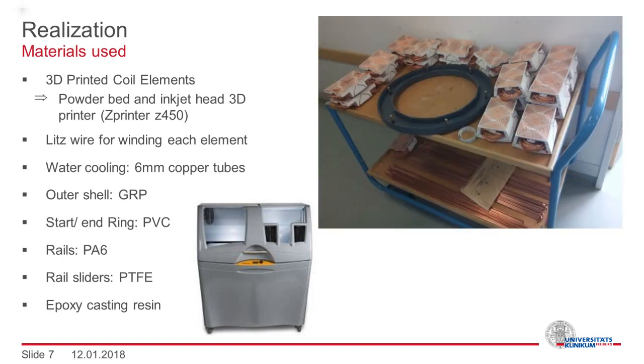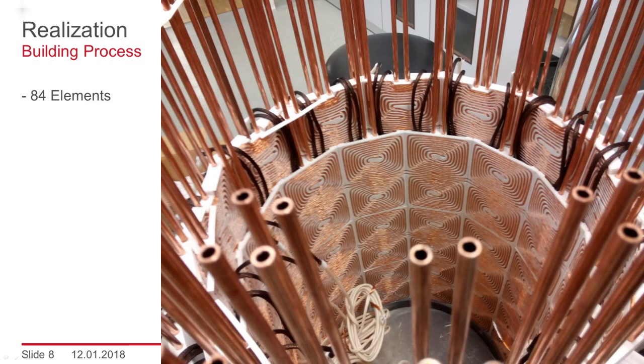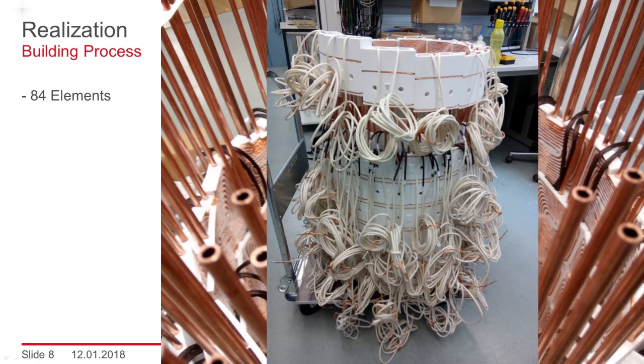In this image, you see everything which is needed to get started: a start ring, all elements for the first two rings, and the copper tubes for water cooling. During the assembly, all elements were slid down the cooling tubes ring by ring. Here you can see the inside of the coil, which shows the stacked layers. All connecting cables had to be fed through the upper elements.